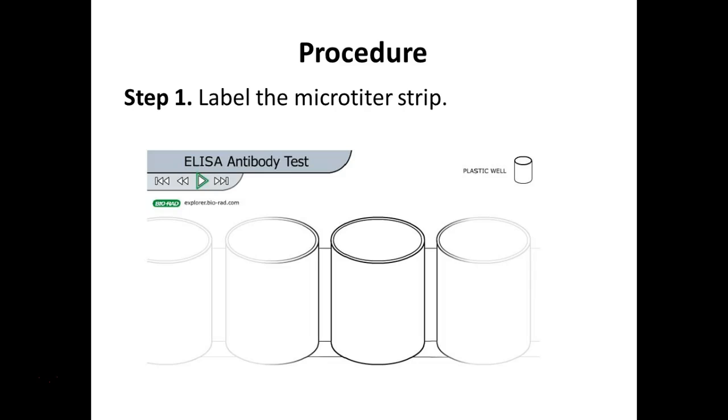So let's take our microtiter strips. So you have a little strip of wells, right?